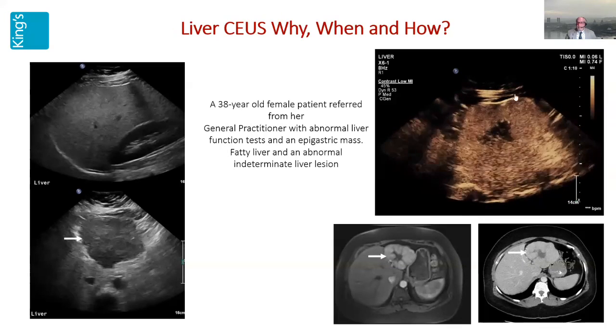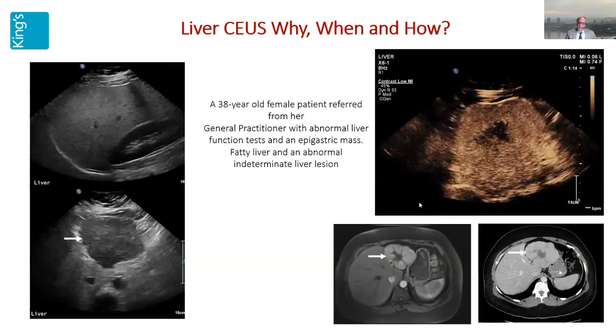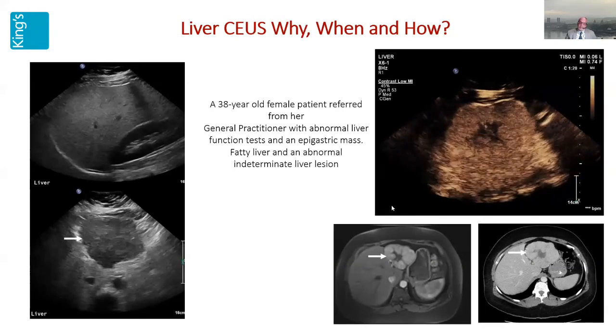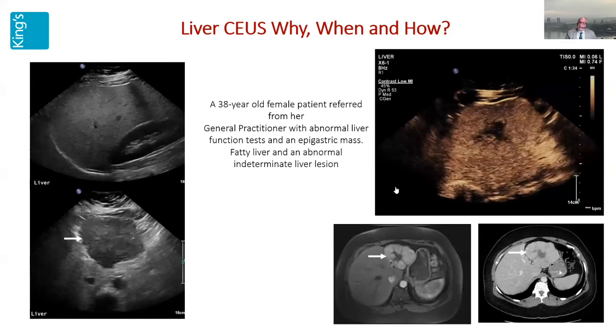But at the time of the examination, when contrast was employed at the same time, it was clear that this patient had a focal nodular hyperplasia, and there was no need to rush through and put this patient on a pathway for MR or CT.